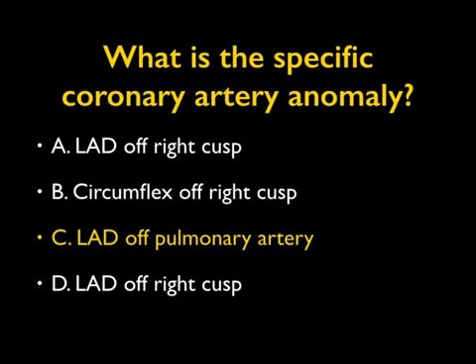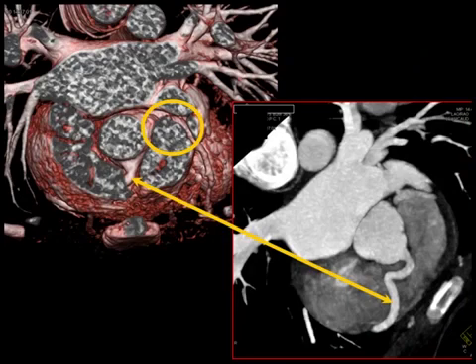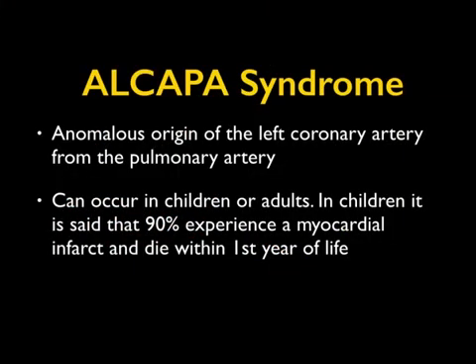That's an unusual anomaly. When reading cardiac CT, one of the most important things is to look at the origin of the vessels, where they end, and where they travel. This is an anomaly of origin, and it goes by an eponym — L-CAPA, anomalous origin of the left coronary from the pulmonary artery.